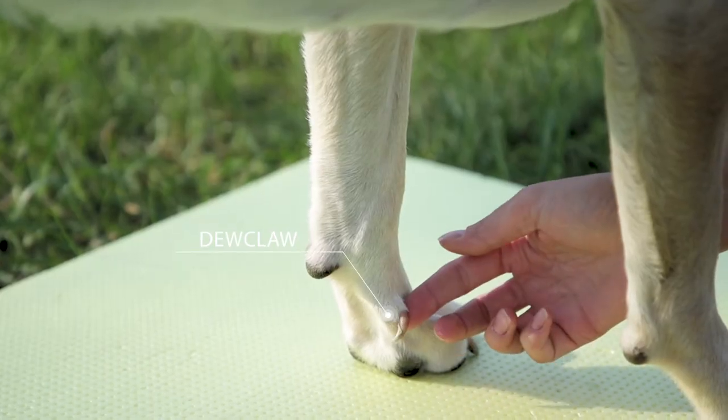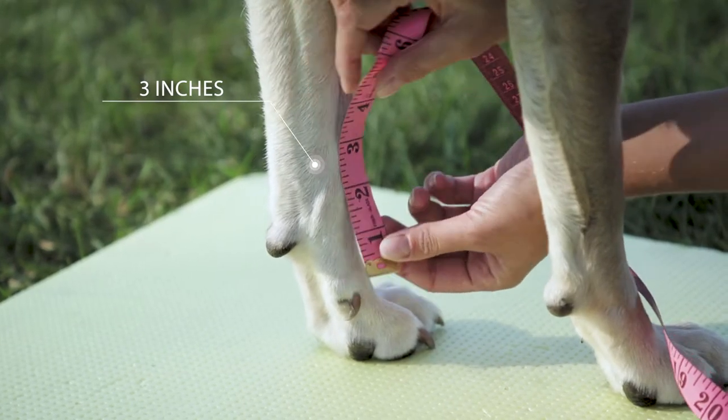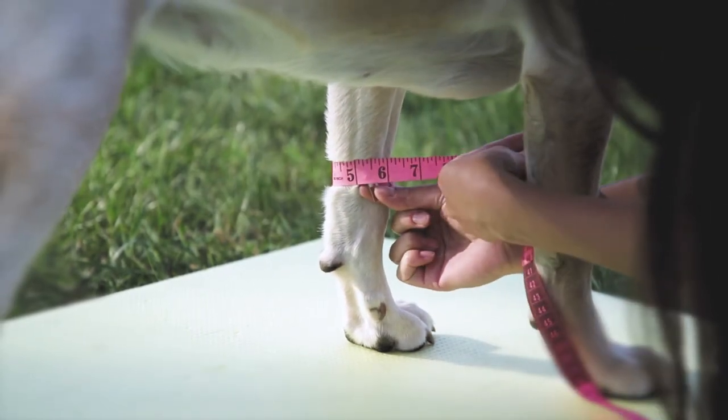Locate your dog's dewclaw, which is on the inside of the leg high above the foot. At three inches above the dewclaw, measure the leg's circumference with one finger under the measuring tape.